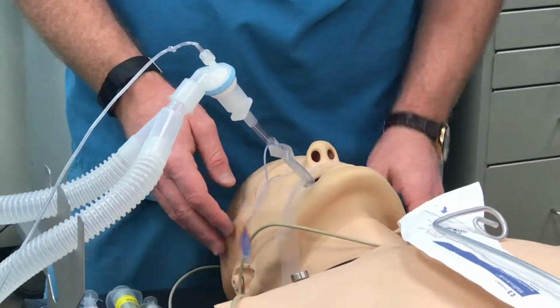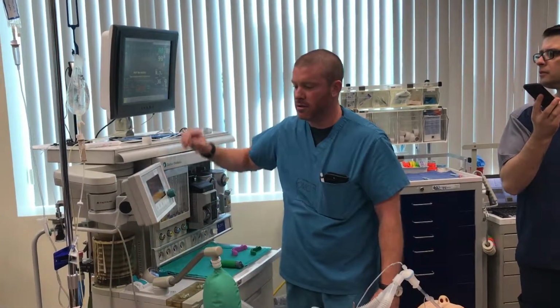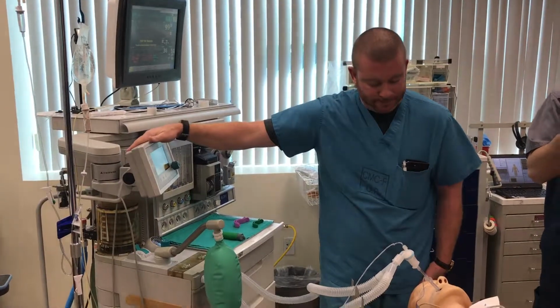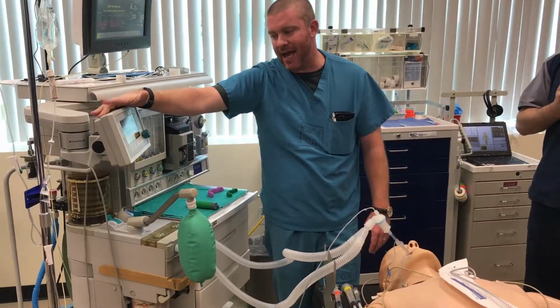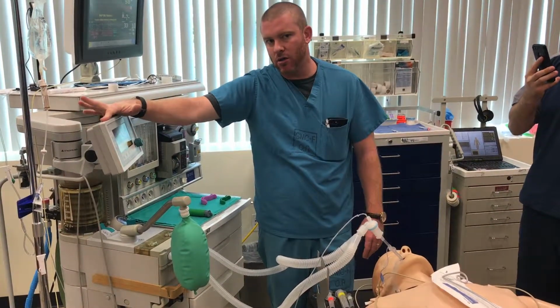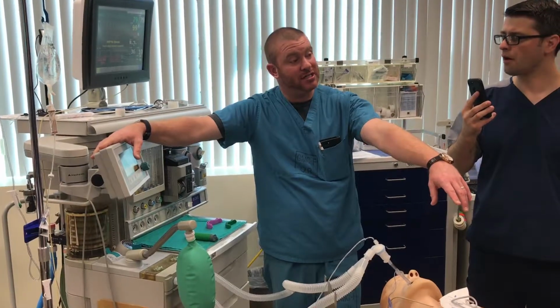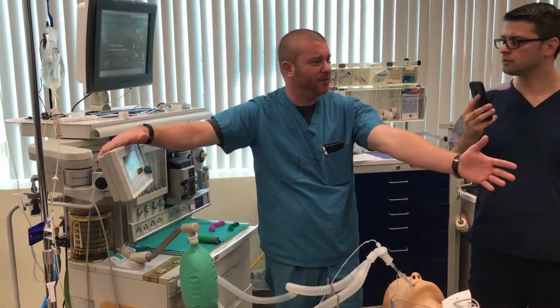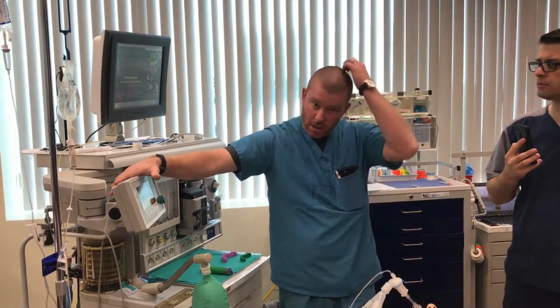Okay, good to go. Silence your alarms, take a look at what it is. It's just your rate. We can turn our rate up. Real quick, so I turned his tidal volumes down to 200. The reason why is because his lungs won't take a 500 cc tidal volume. If we do that, and we'll inevitably have to replace a couple lungs with you guys, I'll tell you that right now, because we'll pop them, right? We don't want to do that.